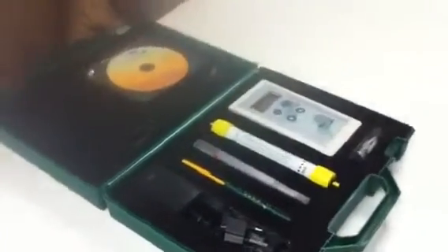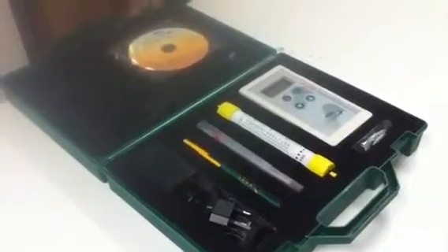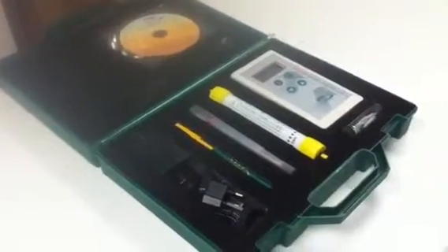This is the HTVM kit. This kit was returned to us for service this morning. If you open the kit, this is the actual HTVM, plus the calibration CD, power supply, etc.